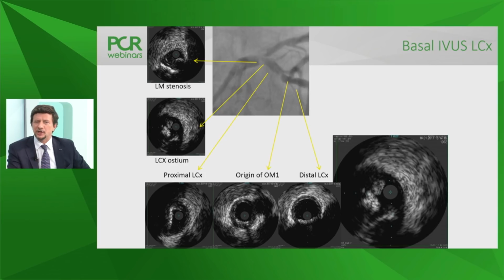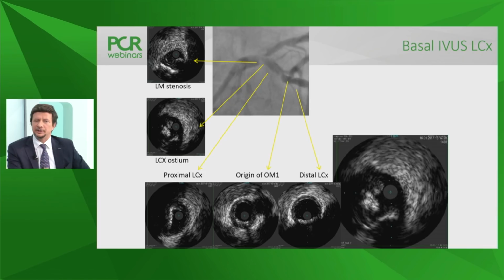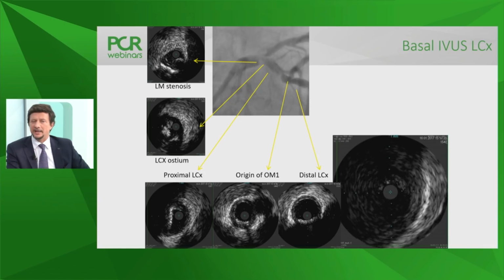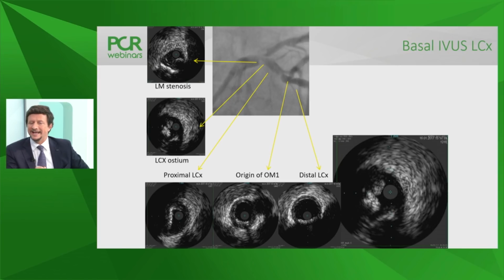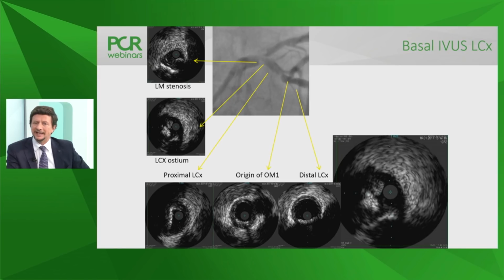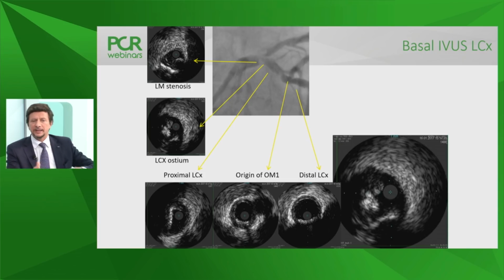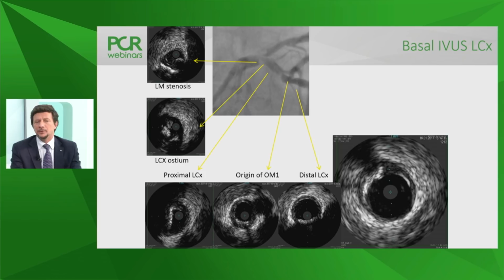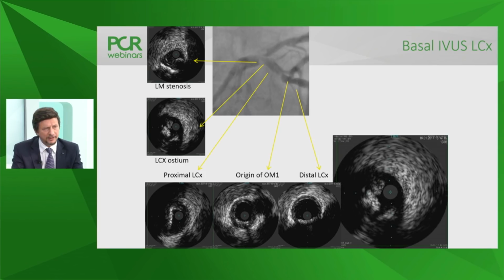But you see how much calcium you have at the point of the bifurcation, and especially in the body of the left main at the point of the minor lumen diameter, which is very tight and again very asymmetric and deep distribution of the calcium. We can see the shadow cone, which is at least half of the circumferential area of the left main. These are very nice images.